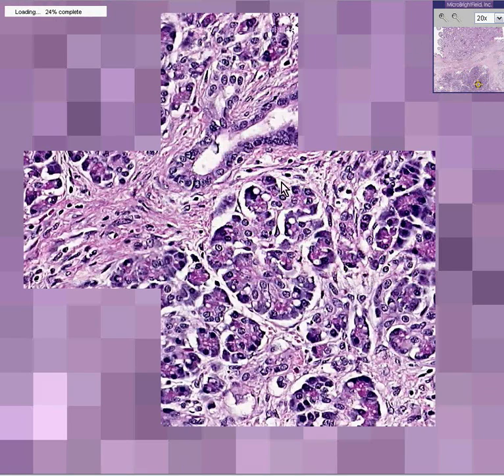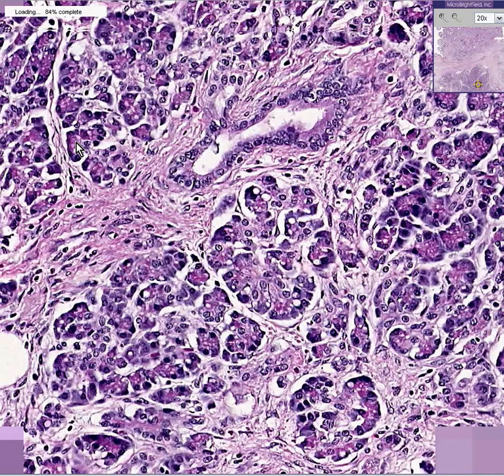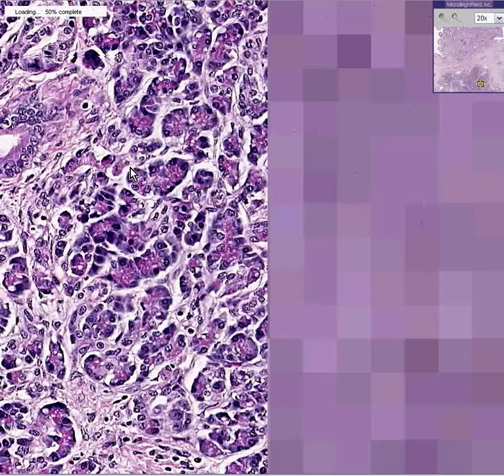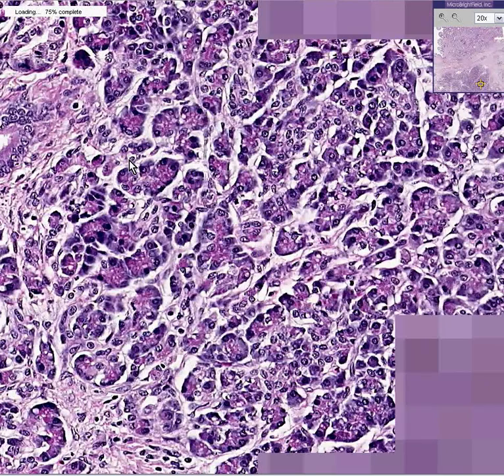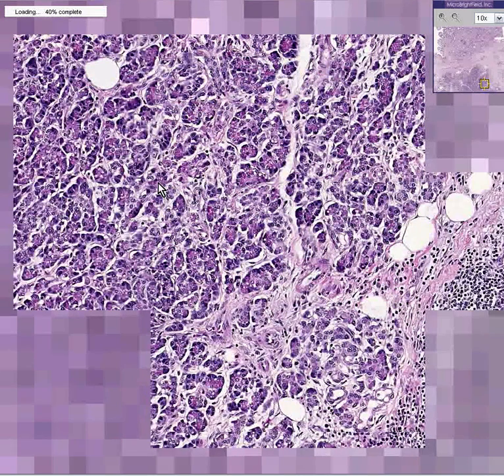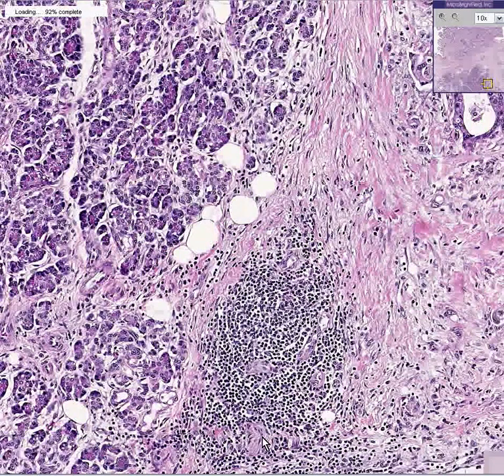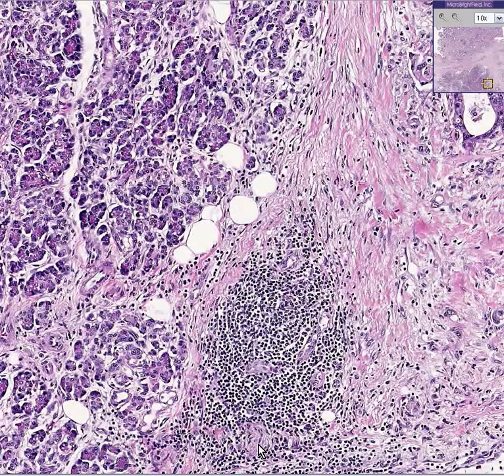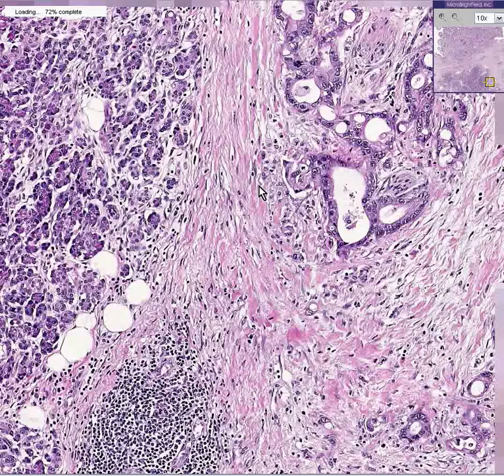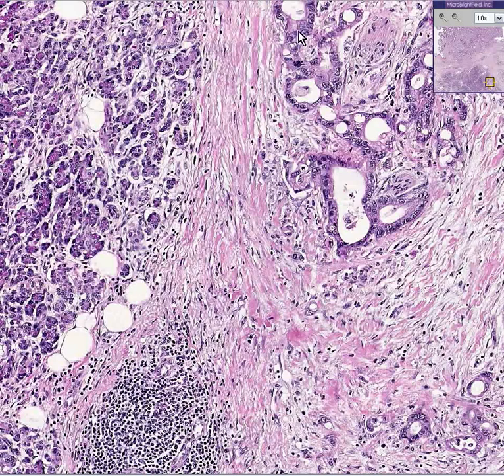I can see intralobular and interlobular ducts. You can see all of these zymogen granules inside the acinar cells — everything that's granular inside these acini is probably zymogen granules. If you move just a little bit out to the periphery of this normal pancreas, you can see that there's going to be a fibrotic area around it. There are areas of inflammatory cells, and we can see these inflammatory cells are around little nerves as well. But there should be absolutely no doubt whatsoever about the difference between these glands of a normal pancreas lobule and these glands of an infiltrating adenocarcinoma.